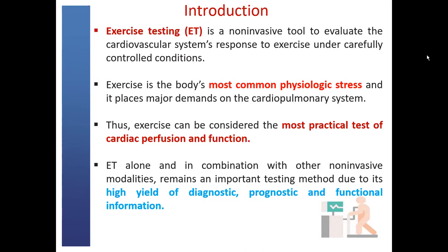So exercise testing is a non-invasive tool to evaluate the cardiovascular system's response to exercise under carefully controlled conditions. Exercise is the body's most common physiologic stress, and it places major demands on the cardiopulmonary system. Therefore, exercise can be considered the most practical test of cardiac perfusion as well as function. Exercise stress alone and in combination with other non-invasive modalities are very important testing methods that have high yield of diagnostic, prognostic, as well as functional information.